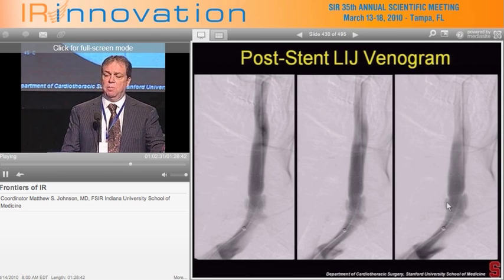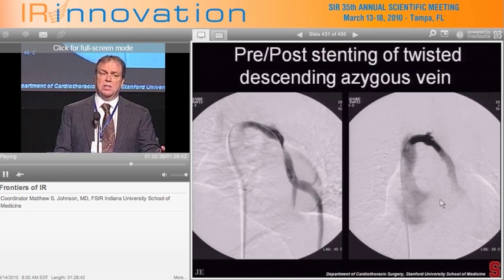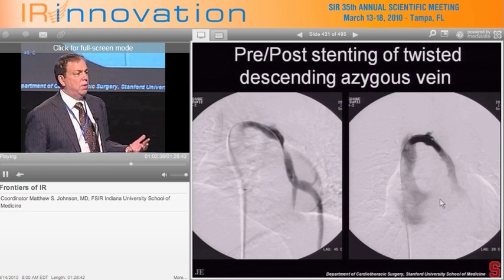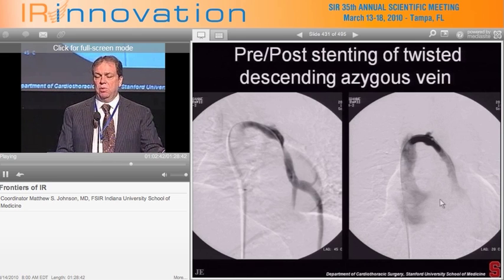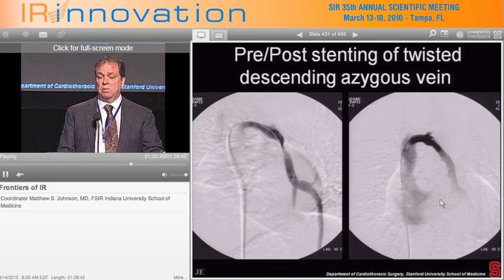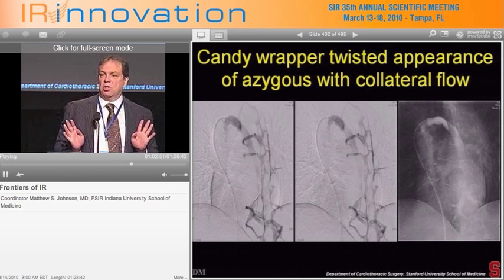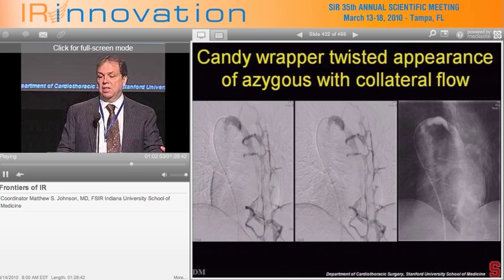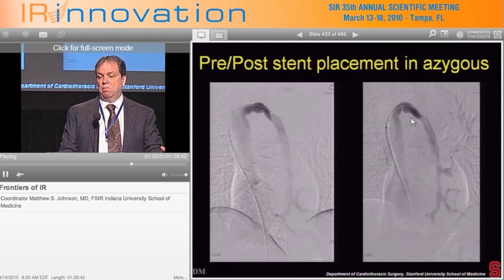The azygous shows a typical appearance at the junction of the horizontal and vertical segment — a 'candy wrapper' or 'bird beak' configuration — which is a constellation we often see. Pre and post stenting images are shown. In my experience, azygous lesions do not respond well to balloon angioplasty. As opposed to collaterals going around the lesion, these collaterals go posteriorly into segmental branches. This bird-beak or candy-wrapper lesion in its typical location is shown pre and post stenting.